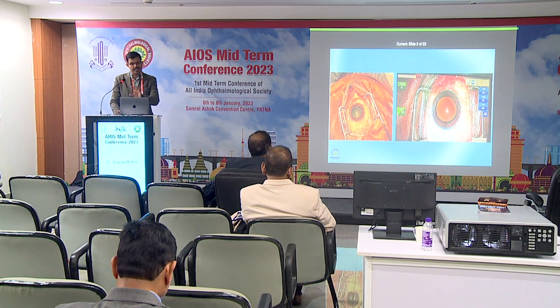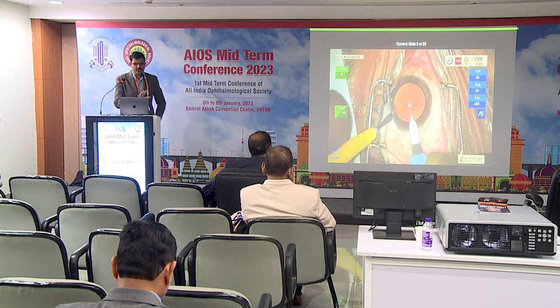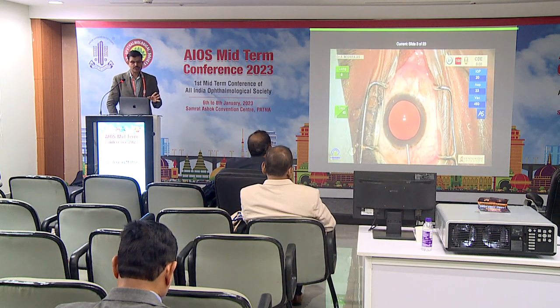This is a picture taken from the monitor. So you can imagine the quality loss that has happened. If there's no quality loss like that, and you get a direct surgeon's view as I'm getting here, you can imagine the view you're receiving. So a very routine case, just look at the movement of the eye. That's something to be emphasized here.